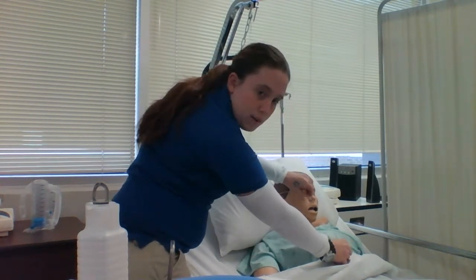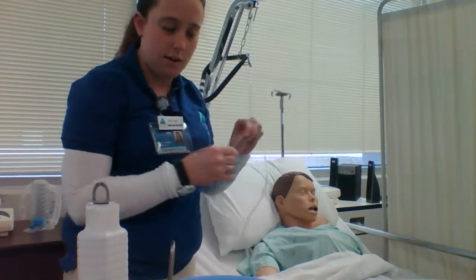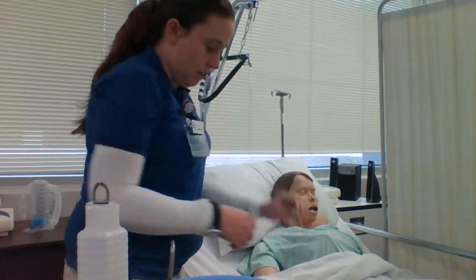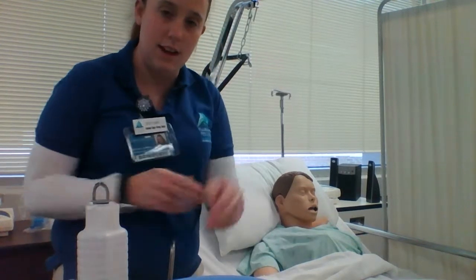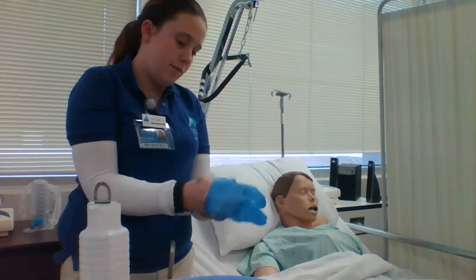To the xiphoid process. Okay, and I'm going to mark my spot, and I'm going to wash my hands again and put on gloves.